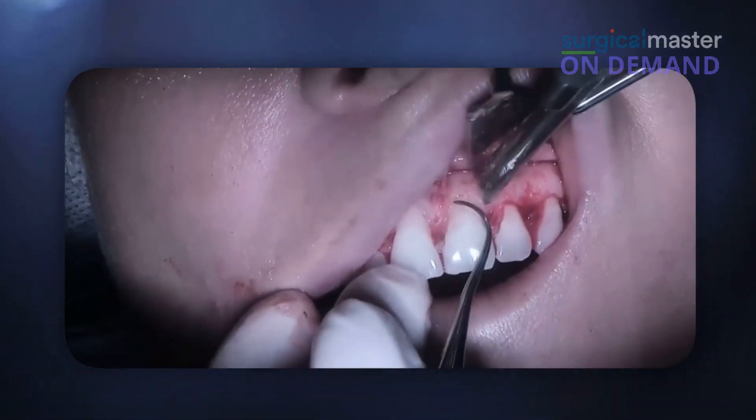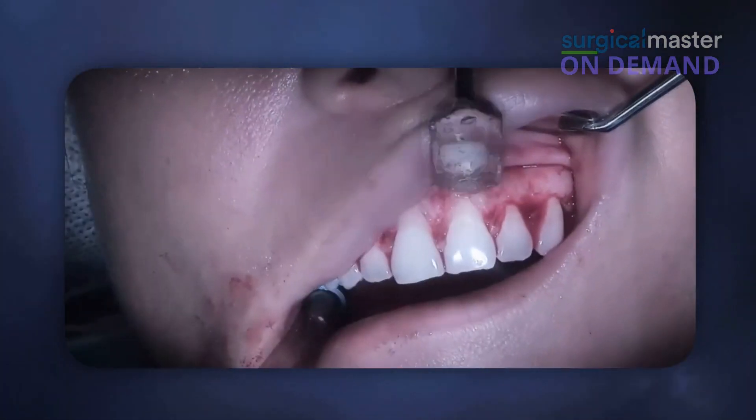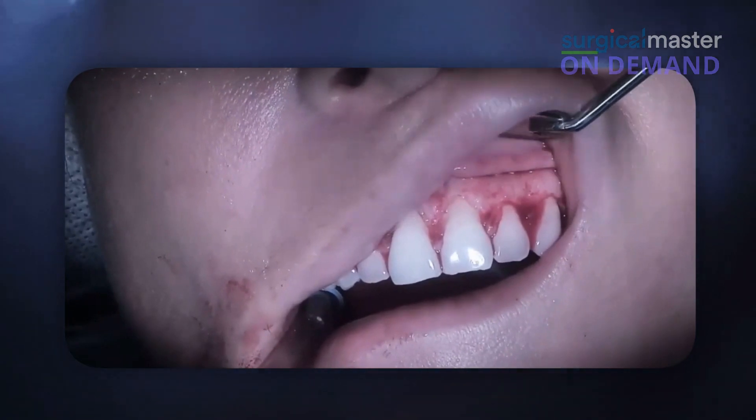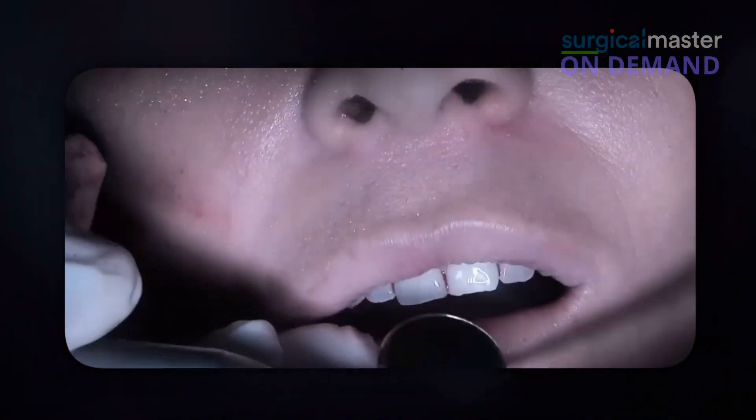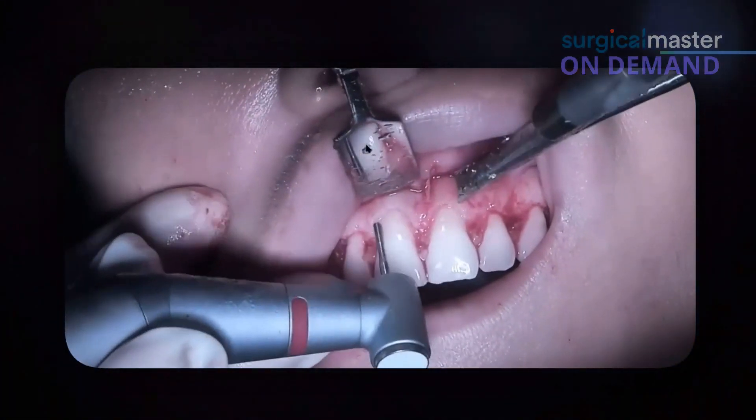It's not an exact science — I'm not a robot. I probably have less tooth-prepping skills than most dentists, but it's not that difficult. Sometimes you need to remove some of the fibers and granulation tissue to allow some visibility. What's important is to retract the flap.